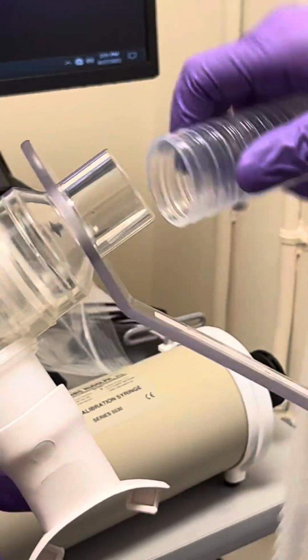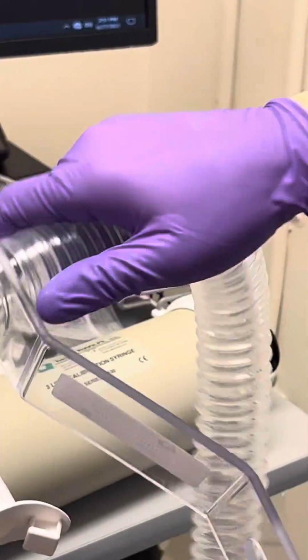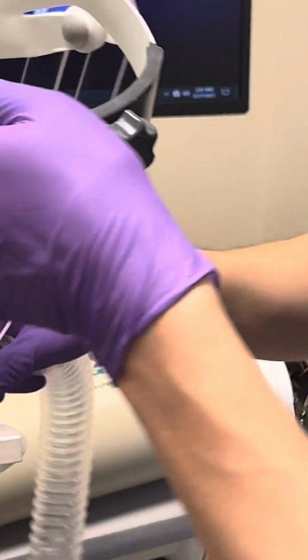Yeah, and I'm looking at it here. It has arrows on top, so it says this and then this. So the outlet, I think, should be here. Okay. So all assembled, this is what it's going to look like.